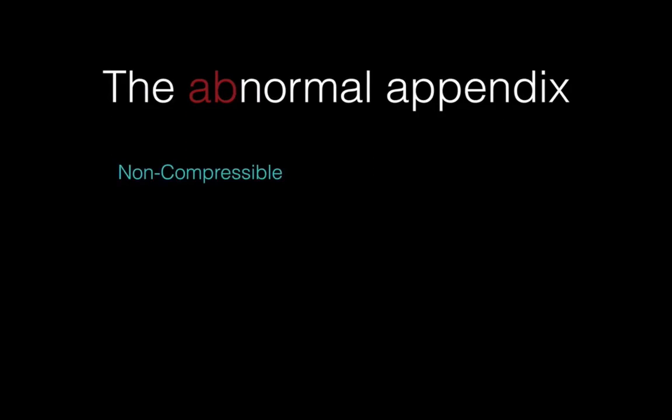So that's very important. You have to be able to find that appendix all the way to the blind end, and I'm going to show you in a couple of pictures why that's so critical. But let's start talking about the abnormal appendix. What makes it so abnormal?